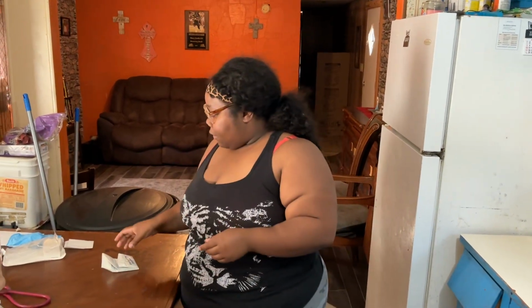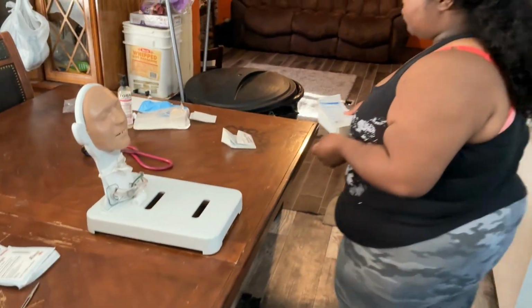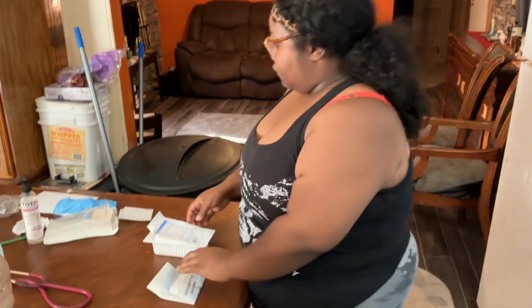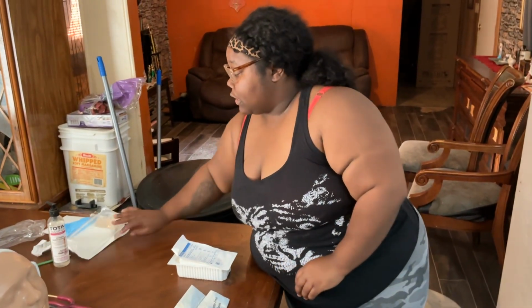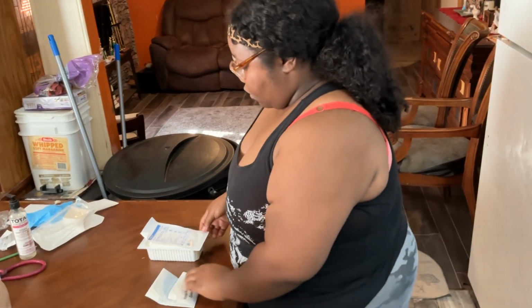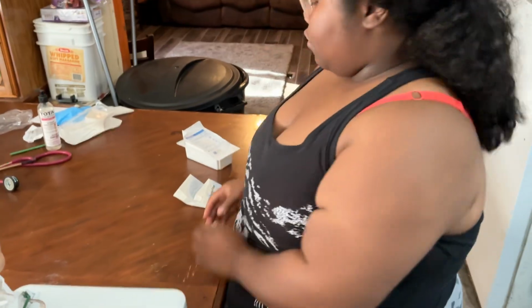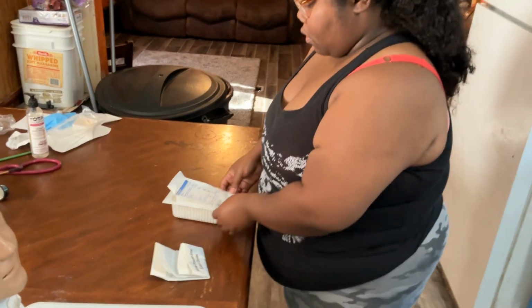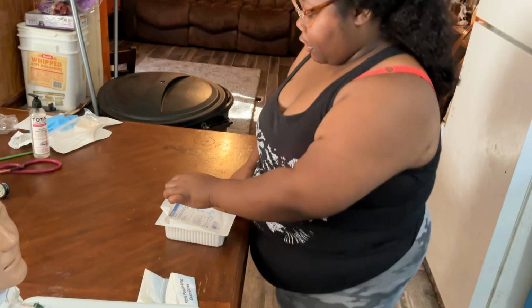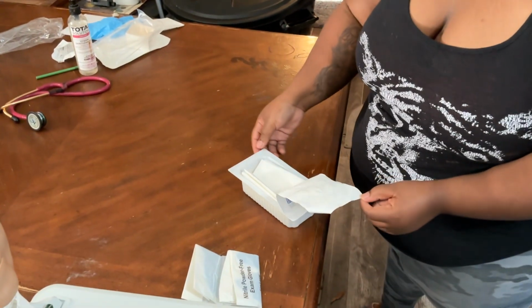Okay. So I'm ready to perform hand hygiene. What I'm going to do now is get my trach care kit. That will be discarded in the appropriate bin at this moment. I do have my tracheostomy care tray. I've already performed hand hygiene. I'm going to open that carefully.